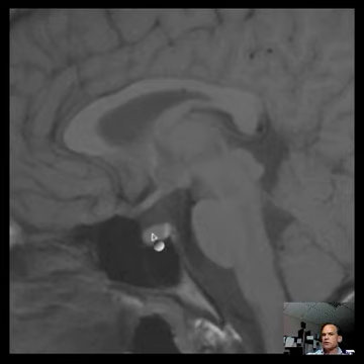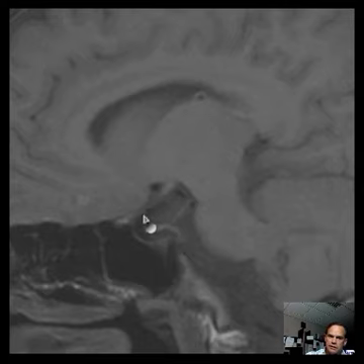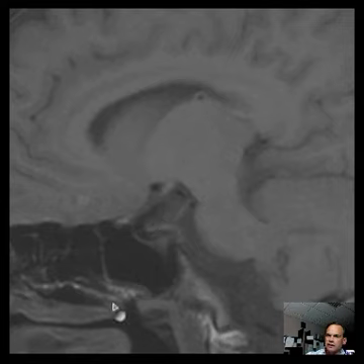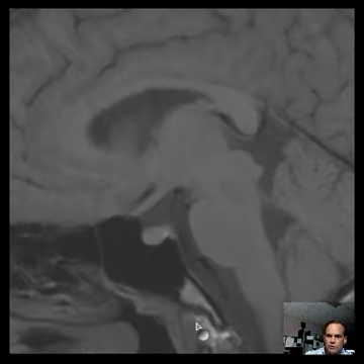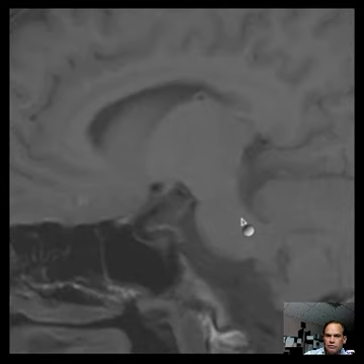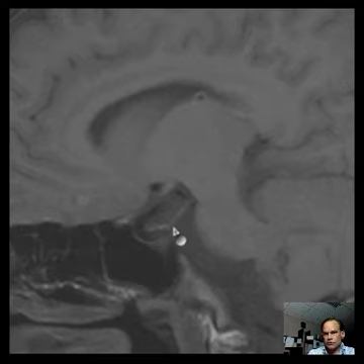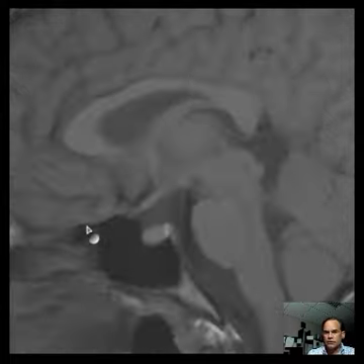When a sellar mass, especially a pituitary mass, becomes sufficiently large, it grows up into the suprasellar cistern — and the first thing it encounters is the optic chiasm, which you can see here. Going to one side, you see the internal carotid artery in the cavernous sinus — entering, doing a little sigmoid S-shape, then exiting. This is the same on both sides. Also visible here is the oculomotor nerve, the third cranial nerve, which controls most of the extraocular muscles and travels through the cavernous sinus before reaching the eyeball.